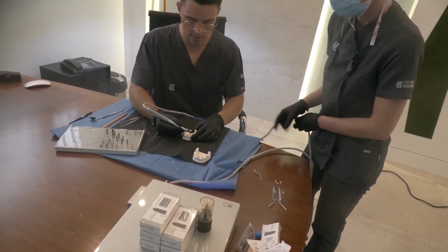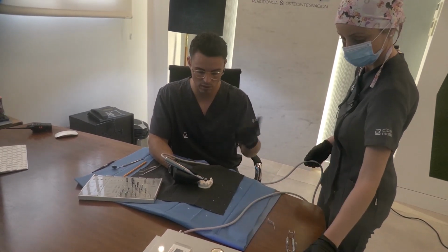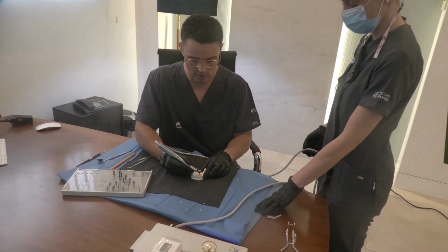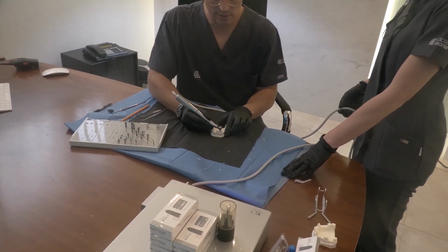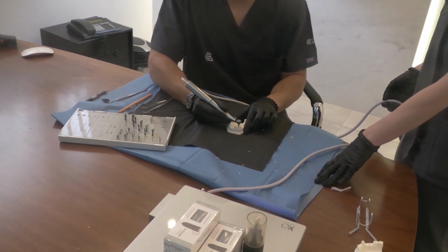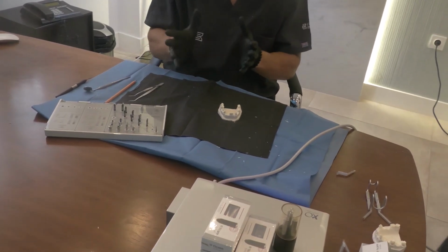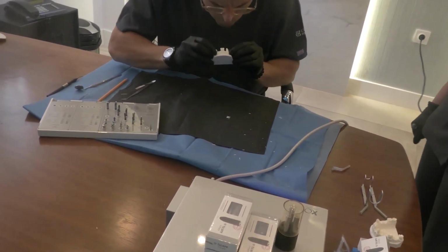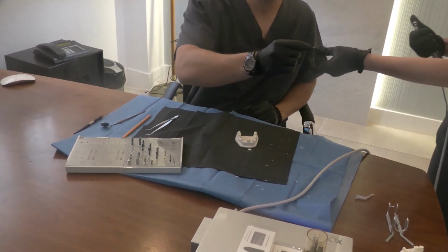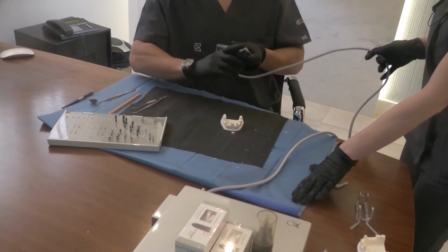Minimize the use of cement, otherwise it may result in residual cement, which is also associated with peri-implant disorders, biological complications. Again, we're going to be drilling down to 13 millimeters in order to place it slightly more subcrestally, aiming at drawing an adequate and harmonious emergence profile for replacing a lateral incisor. We go for the second drill, which is the 3 millimeter diameter drill.